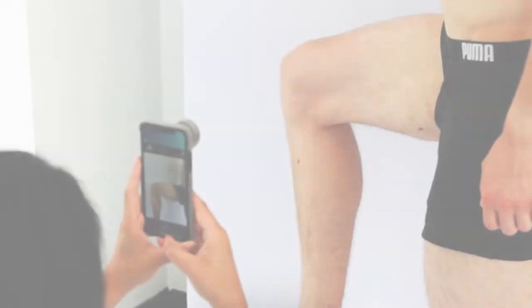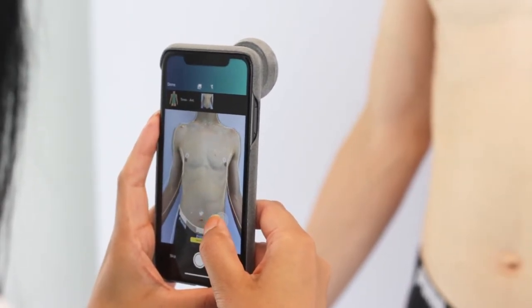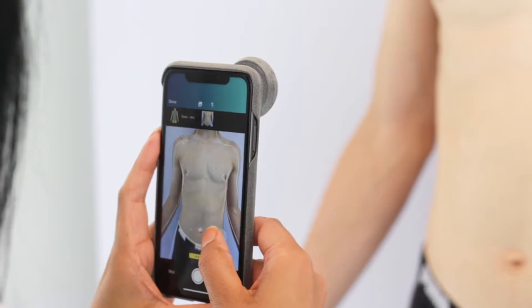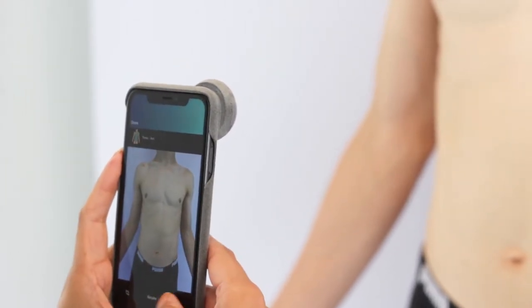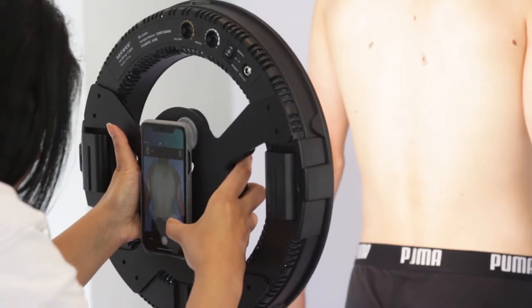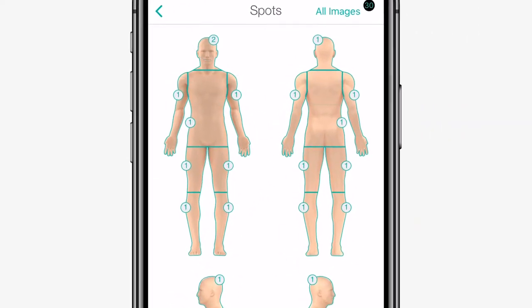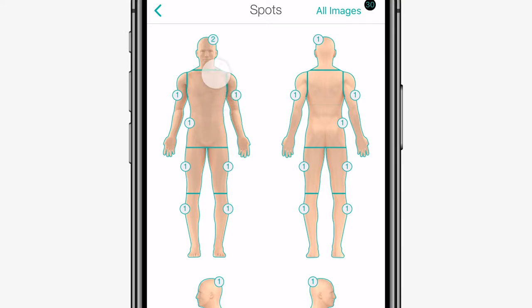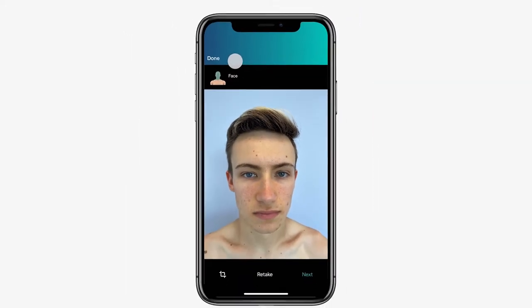It is extremely important that image acquisition is done correctly. For high quality images, maintain a distraction-free and consistent background in a well-lit space. In order to provide even lighting, it's recommended that you use the Optima Light attachment. Next to each body part segment, you'll notice the number of images uploaded for that patient. Simply select the body part you wish to image and then tap the camera icon.